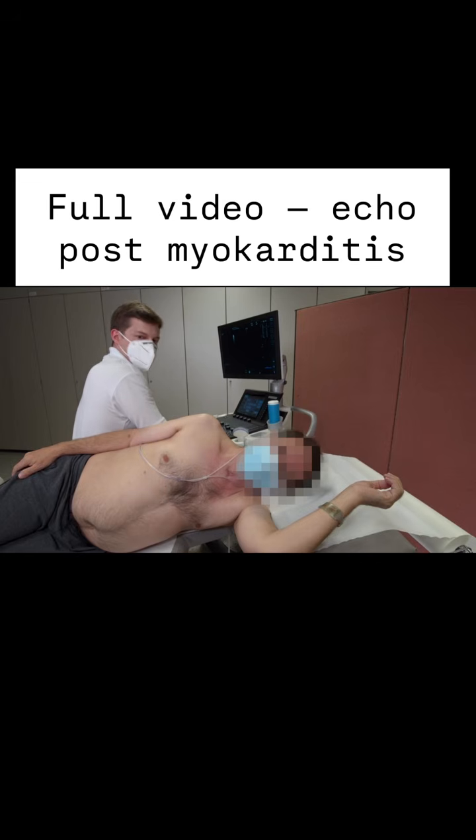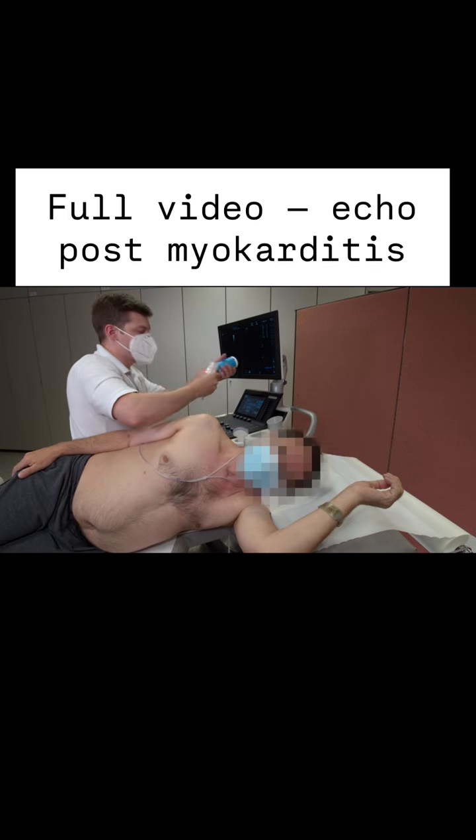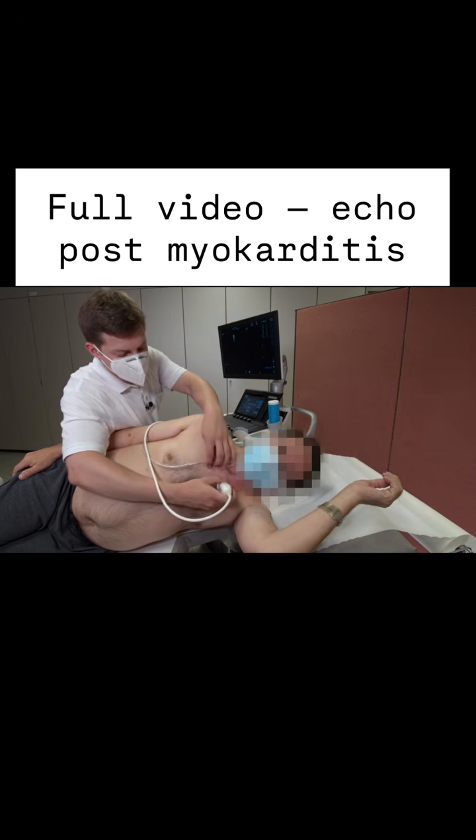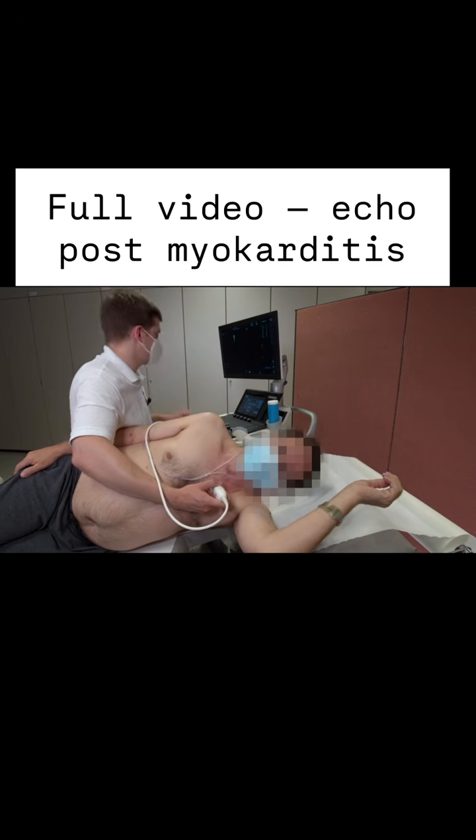We are now evaluating this patient's heart for signs of residuals of myocarditis. This patient had an ARDS because of an influenza pneumonia, and we want to see how the heart and the echocardiographic features are now a few months after the acute disease. And we start scanning, and we do see that the patient still needs oxygen.